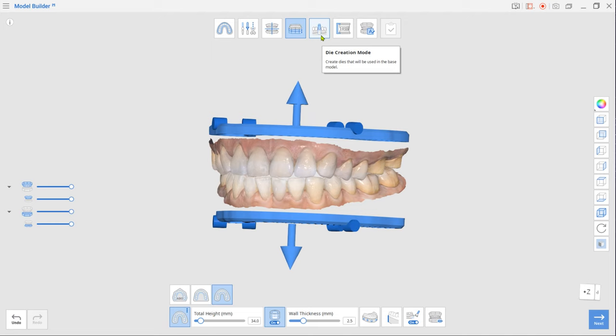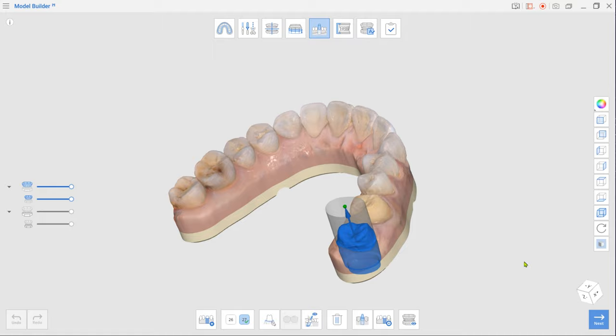When done, move to die creation mode. If you drew margins for the prepped teeth in MeditScan for clinics, your dies would be created automatically.